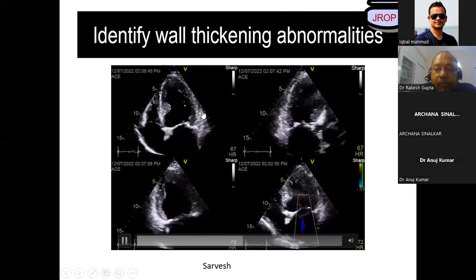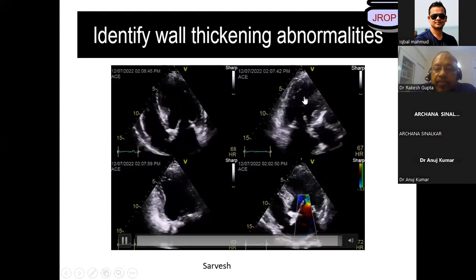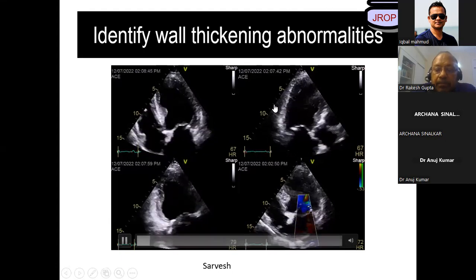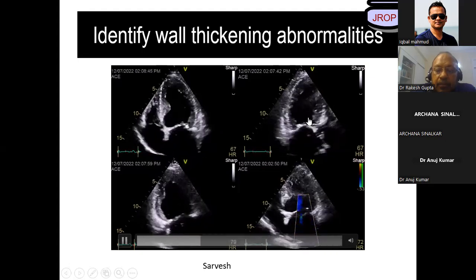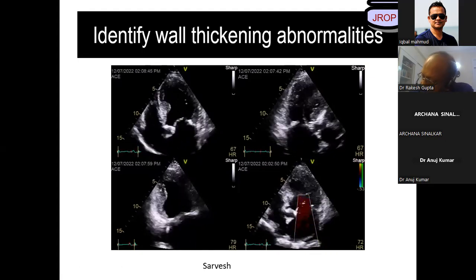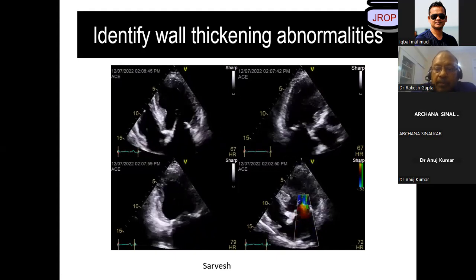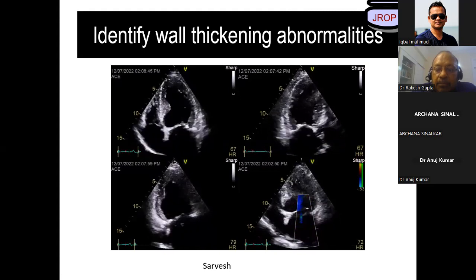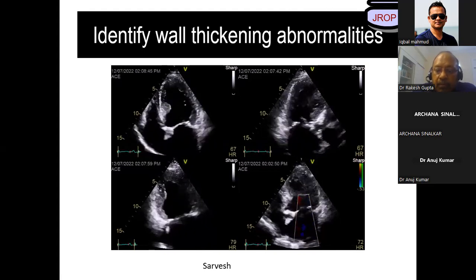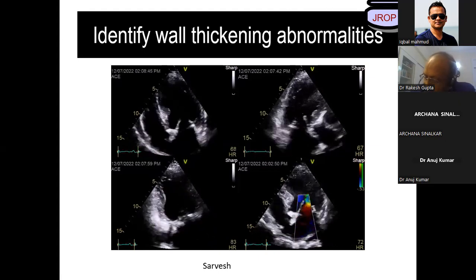Yes or no? All right. In this view, Archana? Basal, sir. Basal what? Archana, where are you located in Mumbai?